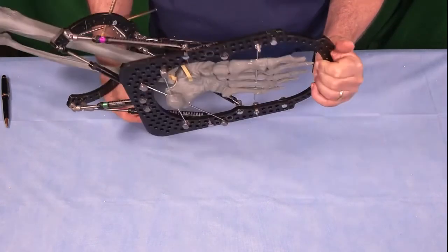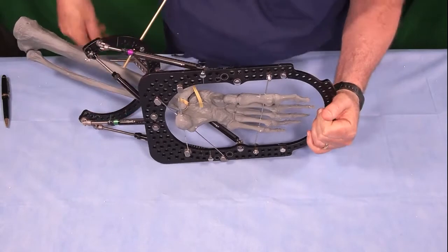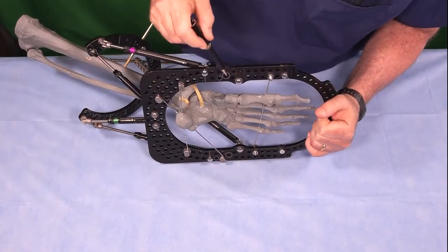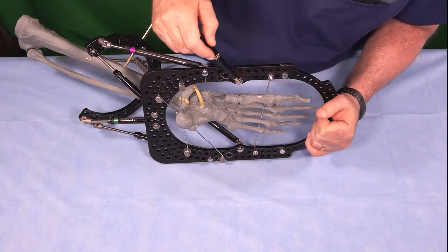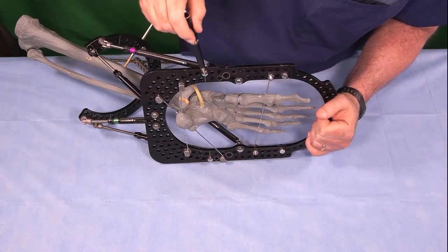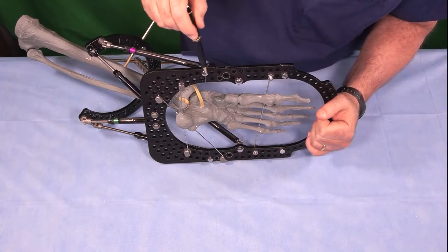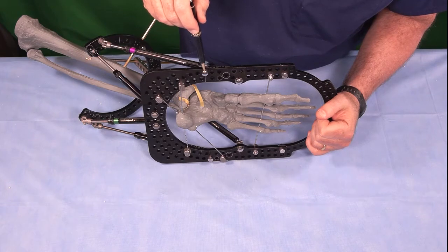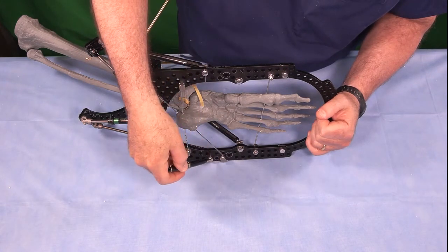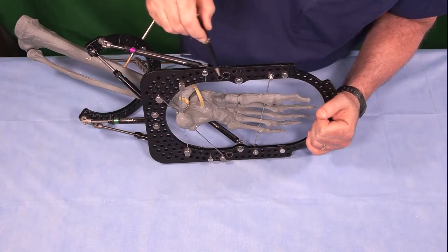Now you notice that the rings have circular holes where you're supposed to put the struts. And I've done it in the back struts and I've done it in these two. But here I've placed this strut in a non-standard configuration. And the software will allow you to enter that you've placed this strut and this strut in this non-standard configuration.